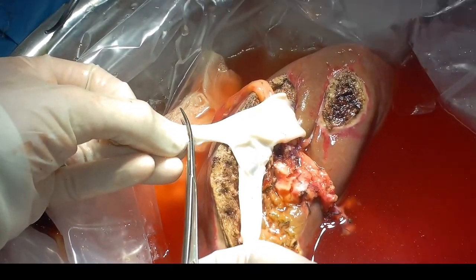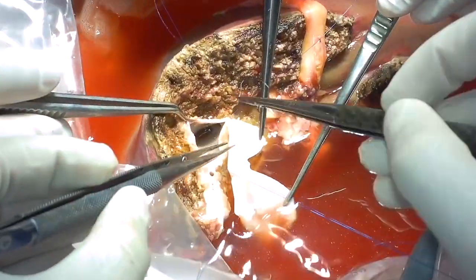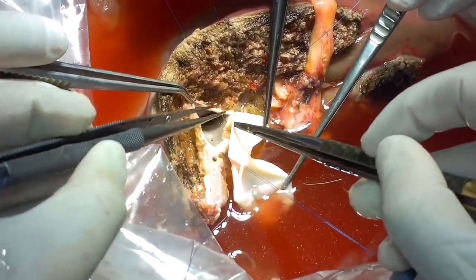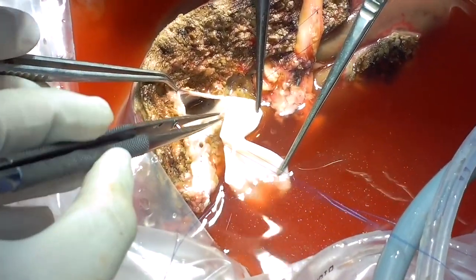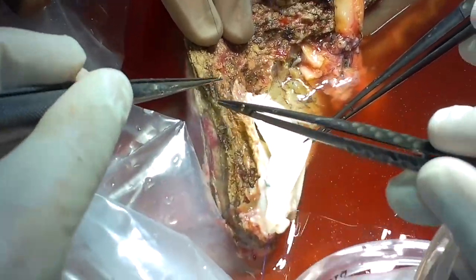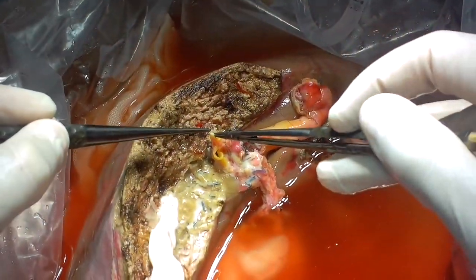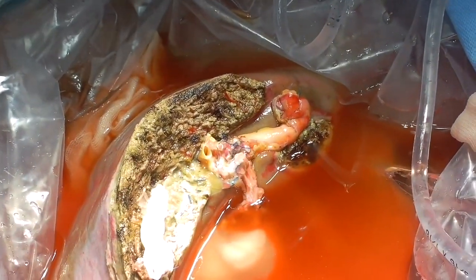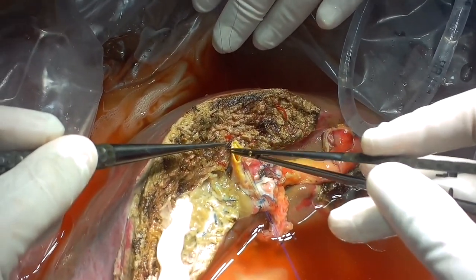Now we are preparing the graft for venoplasty of the left hepatic vein using a vascular patch. In this way, we perform plasty of the left hepatic vein. As soon as we have completed the left hepatic vein plasty using a patch from a cryopreserved graft, we proceed to ductoplasty. We join the middle walls of the bile ducts to create a common orifice.